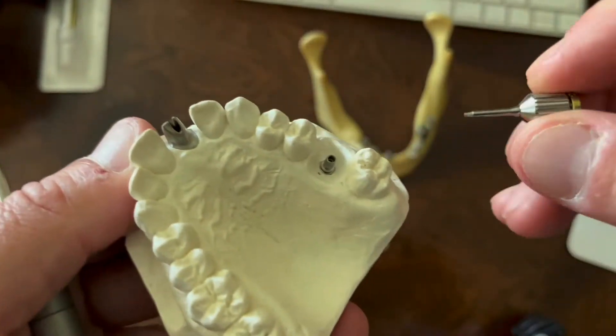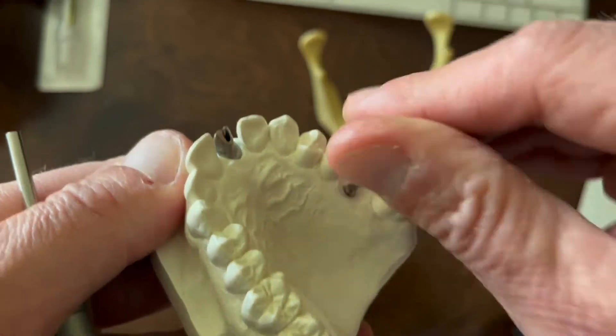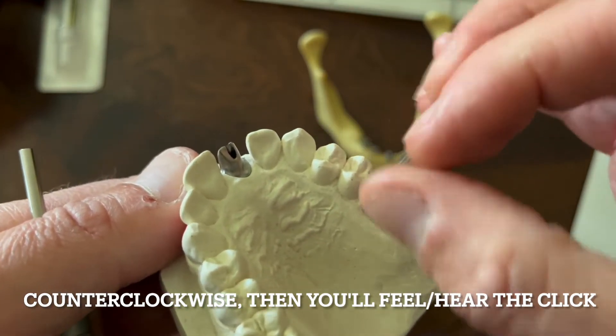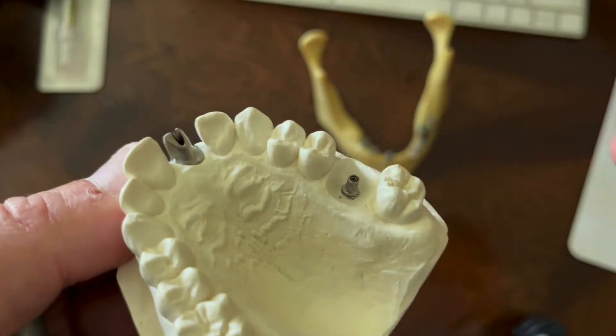If we were to back the screw all the way up — I keep turning it here, click, click, click — I know that the screw is backed up out of the implant.